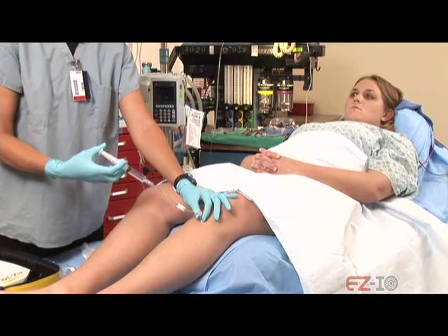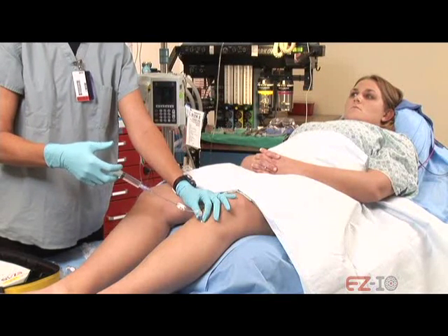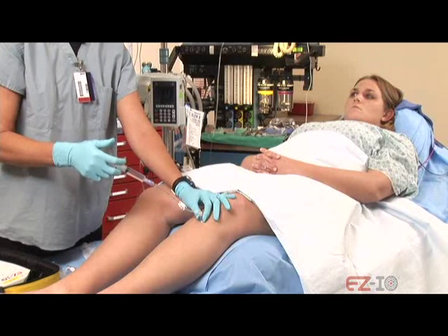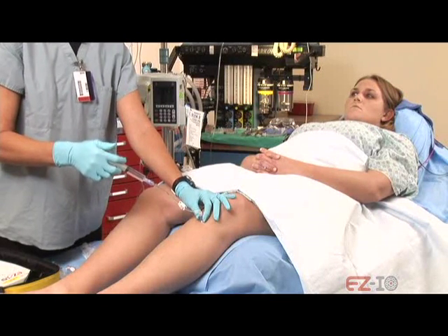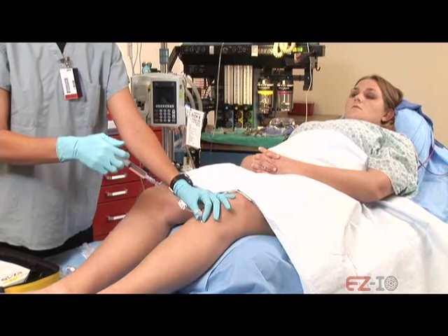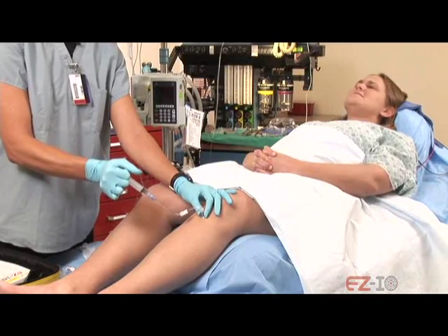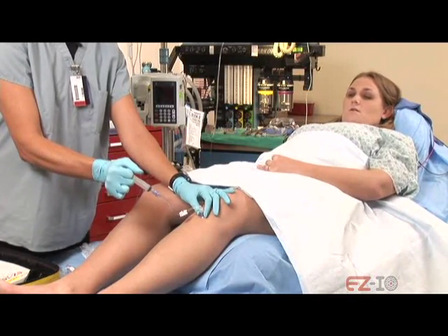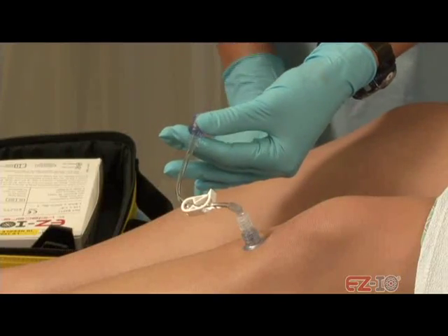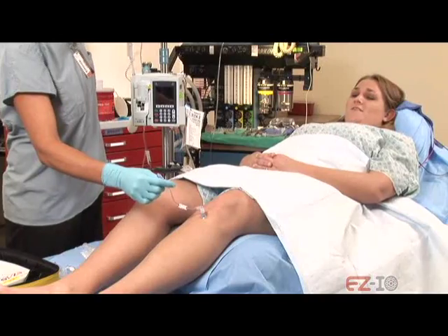All right. Now this next flush needs to go in pretty quick — it's going to take me about 5 seconds. I'm just going to count down with you. You're going to feel some pressure and some stinging pain. I'll be done in 5 seconds, okay? Are you ready? Yes. Okay. 1, 2, 3, 4, 5. Okay. What's your pain level right now? Like a 4?